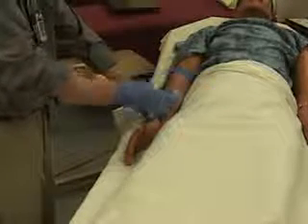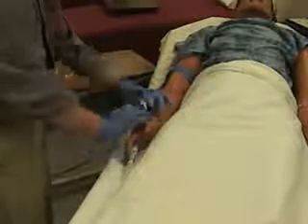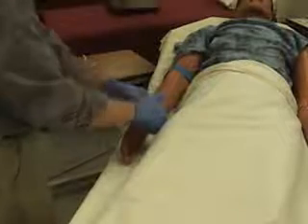Flush the normal saline through the lock and the catheter. Remember, your non-dominant hand should still be holding the catheter in place. Secure the catheter by placing the opsite over everything except the clamp on the lock. Use tape to further stabilize the catheter and the lock.